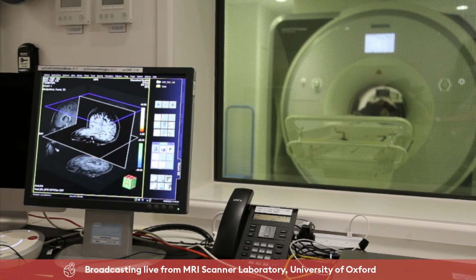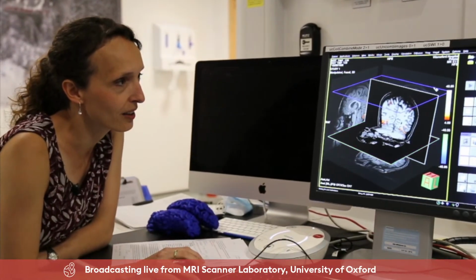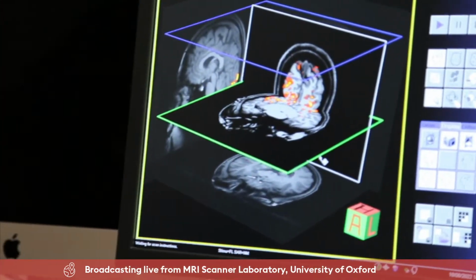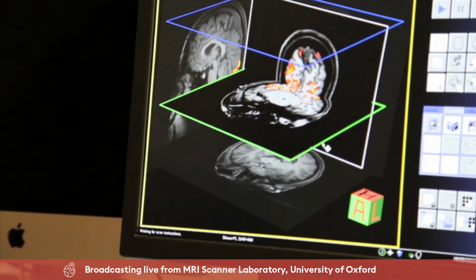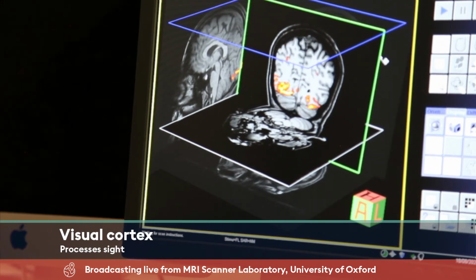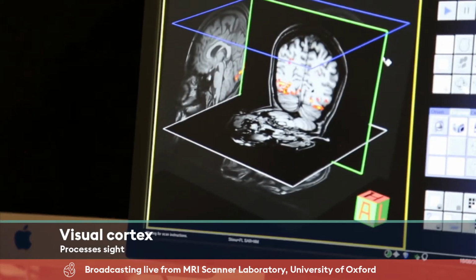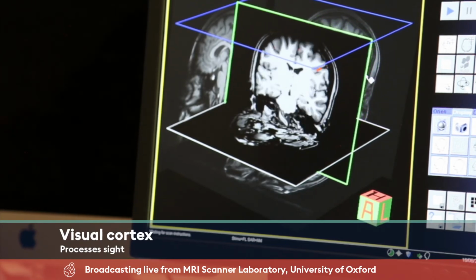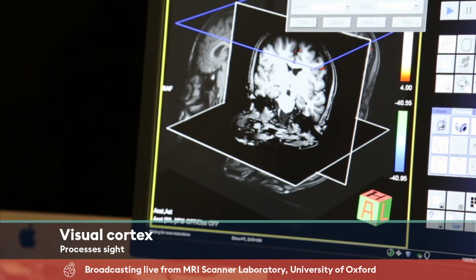Right, I will have a look at these images that have just come in, and I will try and point out the things that we see. As a reminder for those who are noting down their measurements, here we have the visual cortex again. Not surprisingly, Barbara was still looking at pictures, so we would expect there to be visual cortex activity. You'll know really well now where the visual cortex is. This is still part of the visual processing hierarchy in inferotemporal cortex, part of the temporal lobe of our brain. And now we're coming to the more interesting bits.